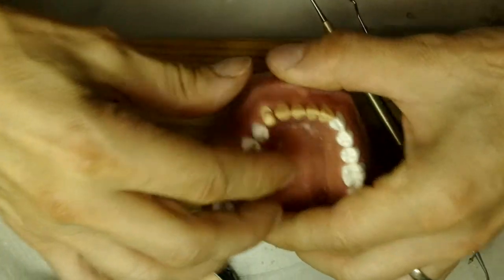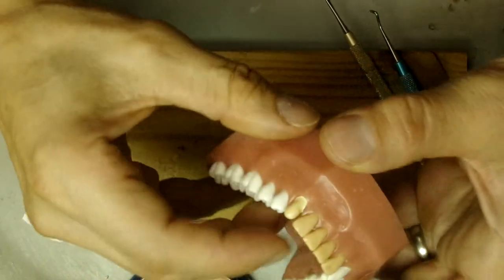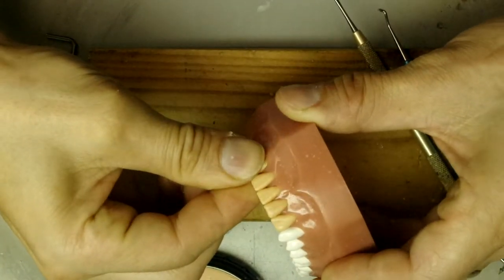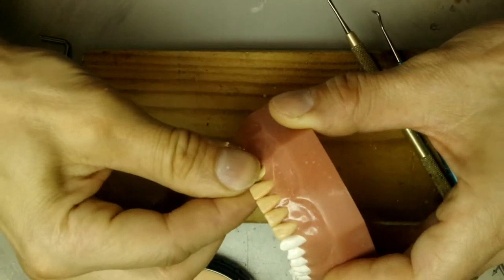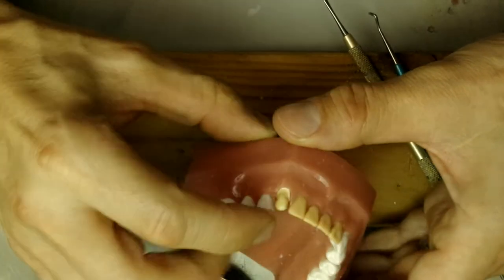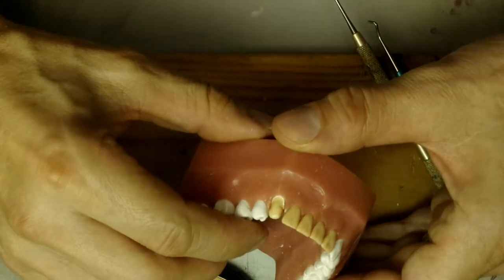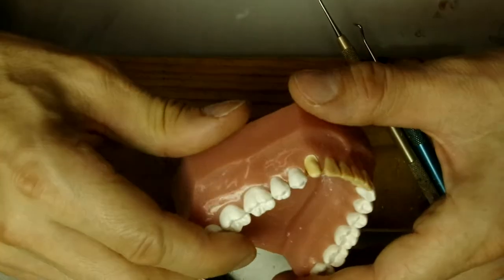Okay, push it down by grabbing the facial and the lingual. Never like this, because you're gonna snap the wax coping right off and you're gonna have to redo it.